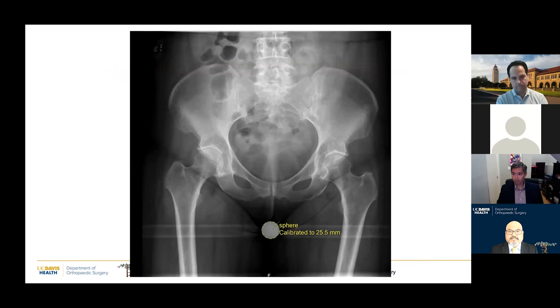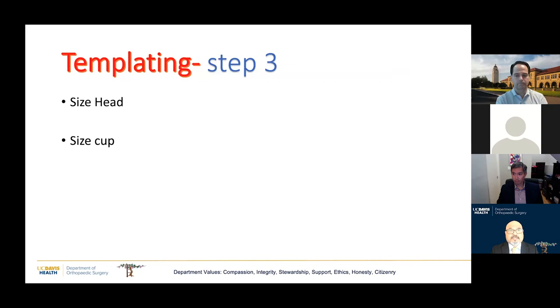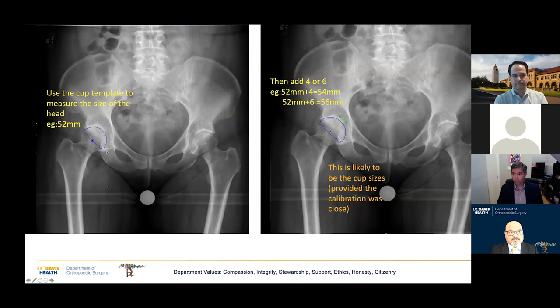The next step is to calibrate the image. Most digital software does this automatically, but PAC software also allows you to calibrate a radiopaque marker. The next step is to size the head. I use the cup template to size the head because I'll use this intraoperatively to validate the templating. Once I measure the head size — a surrogate of the AP diameter of the acetabulum — I add four and six millimeters to get two numbers, which are the most likely cup sizes I'll find intraoperatively, provided calibration is close.